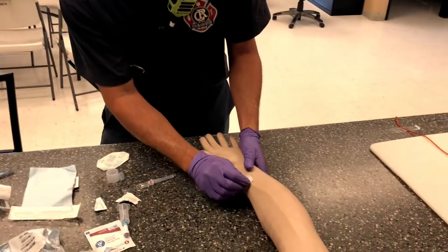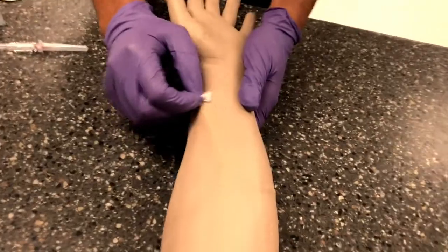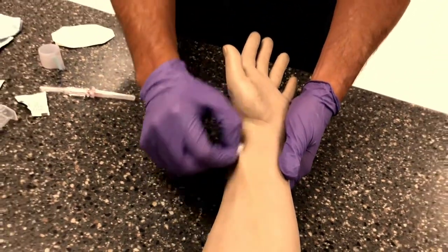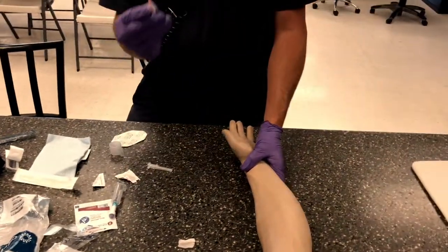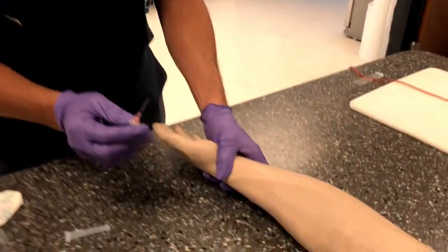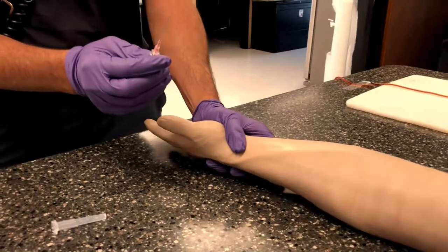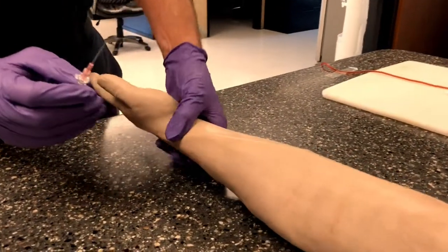I'm going to apply our alcohol swab. And remember, it's always an aseptic technique. We make a nice little small circle, we circle out from there. Once we're comfortable with that, we got our needle. Remember, bevel up. Good traction is always gonna be your friend. In the hand, as low as we can, we pull the hand back in the flexed position. We'll demonstrate this better on a live patient in a few minutes.